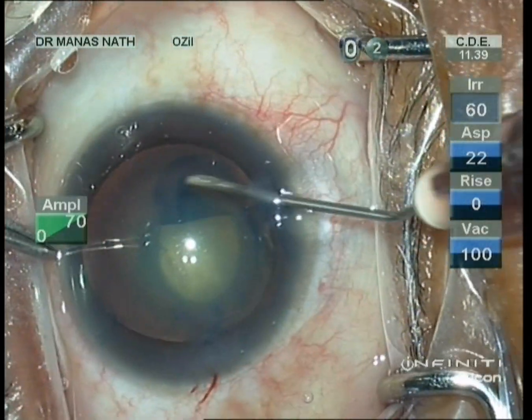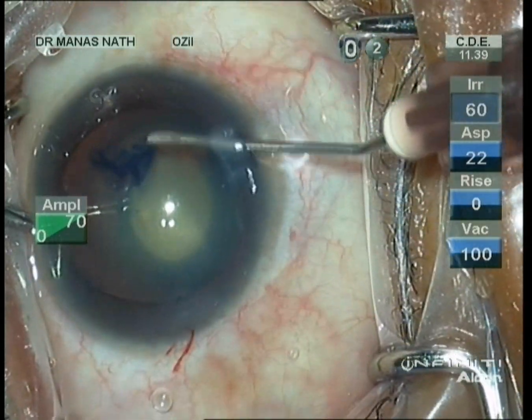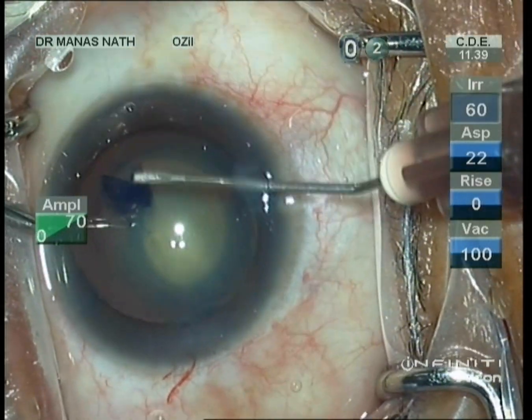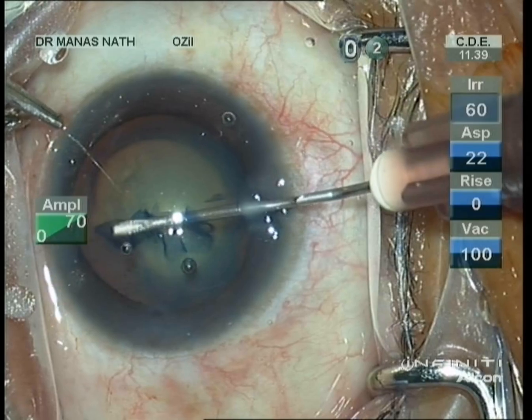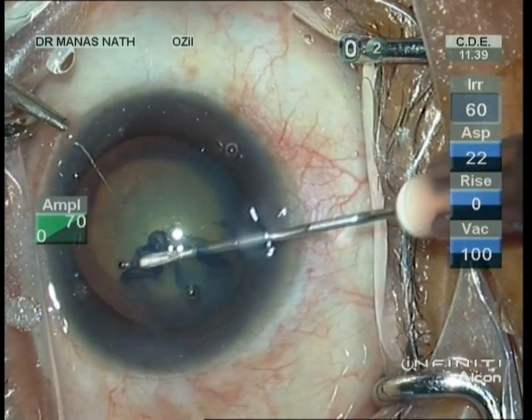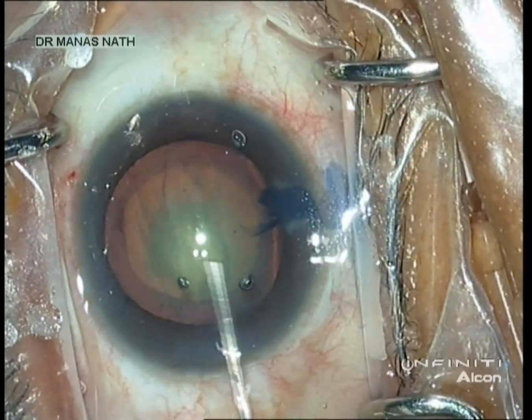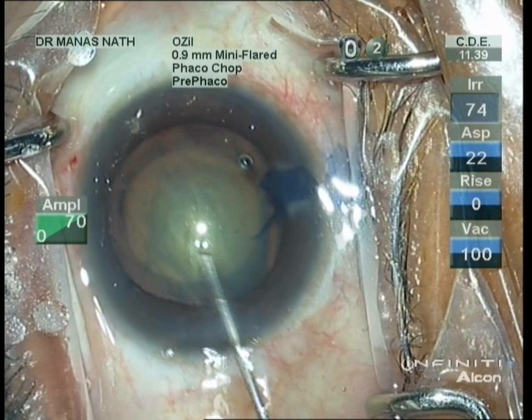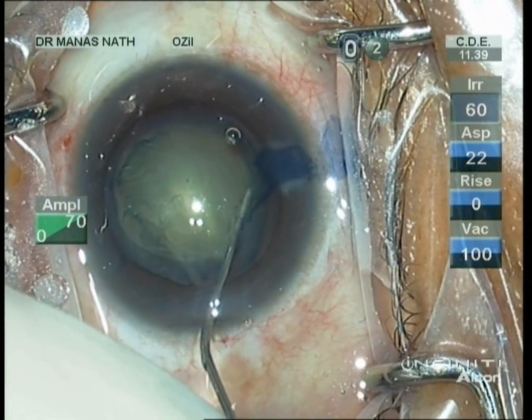The plan is to do a capsulorhexis of around 4.5 to 5 millimeter size. After completing the capsulorhexis, as we have to avoid hydrodissection, I am doing hydro-delineation here, after removing some of the viscoelastics from the anterior chamber.